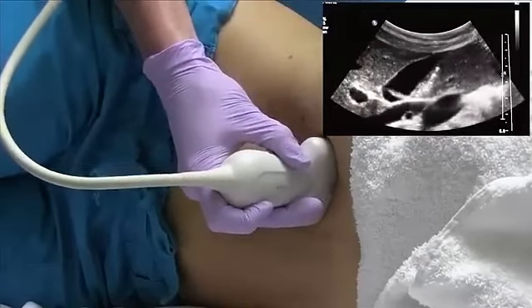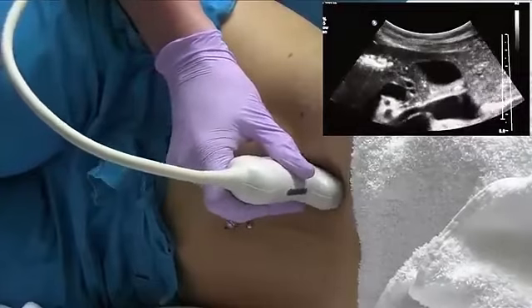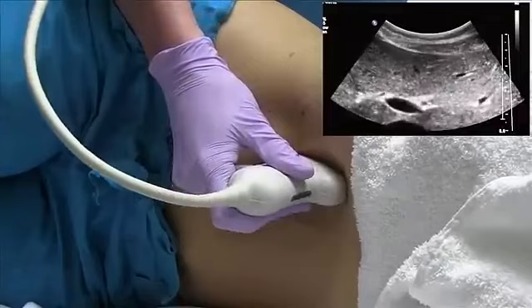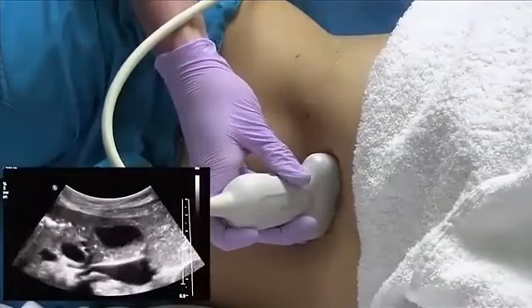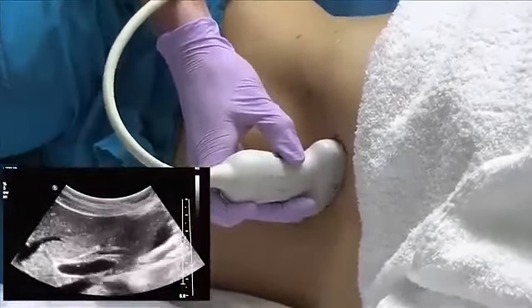Once you get your sagittal sweep, you're going to want to turn your probe 90 degrees again and sweep through in a transverse plane just to make sure you're not missing anything. You can also see the porta hepatis and the CBD from this decubitus position as well.